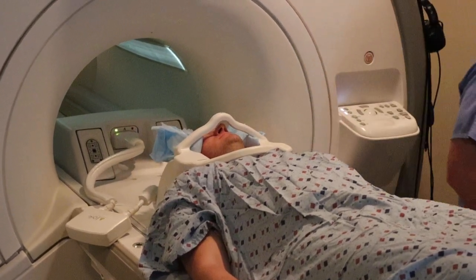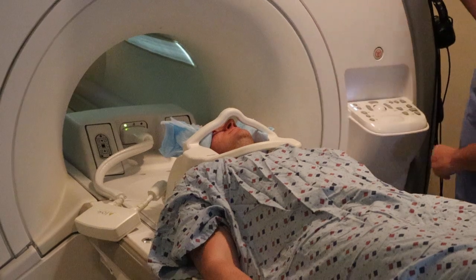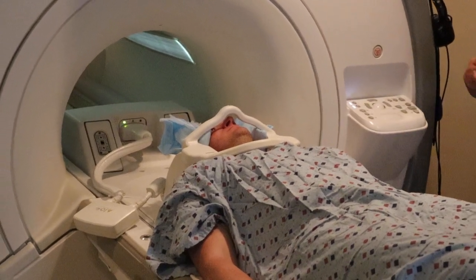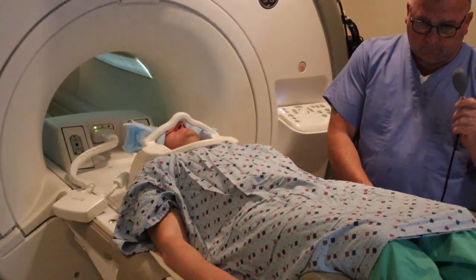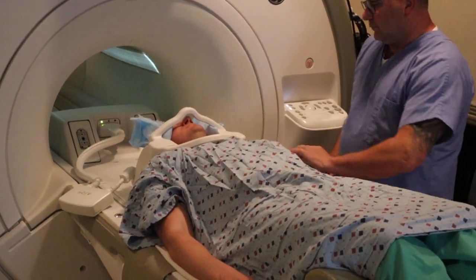The technologist is providing stabilizers to the left and right side of the head to keep the neck nice and straight. He's going to provide the panic ball in case the patient needs to communicate with the technologist.